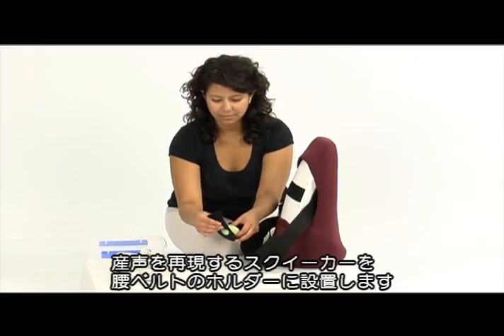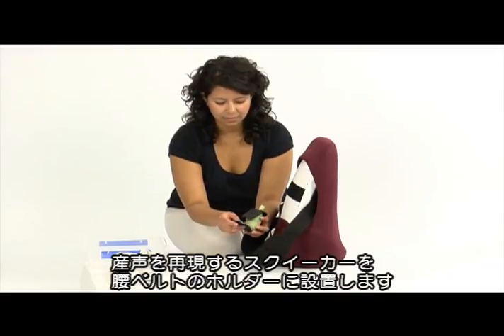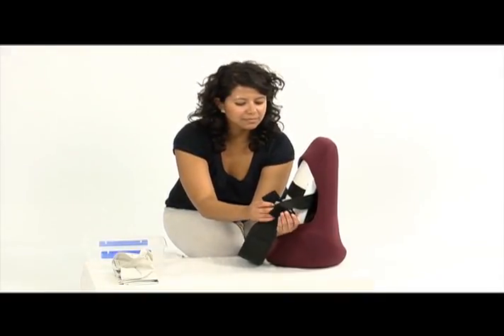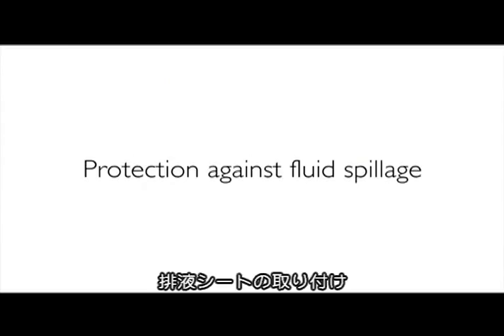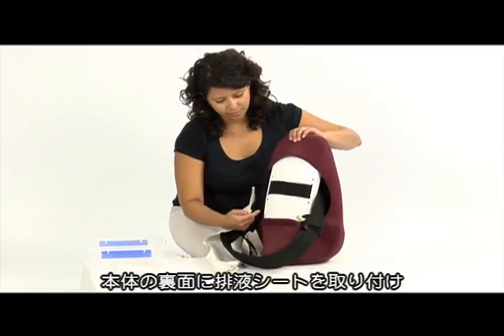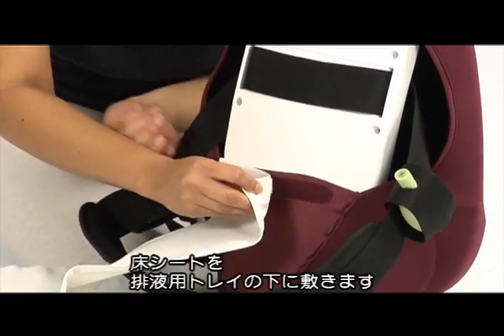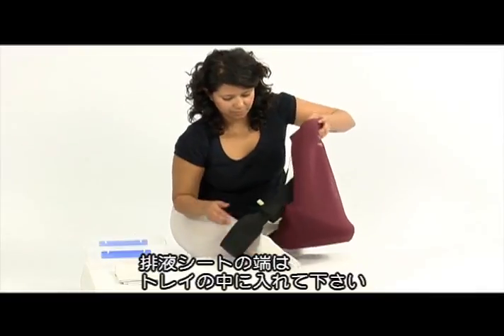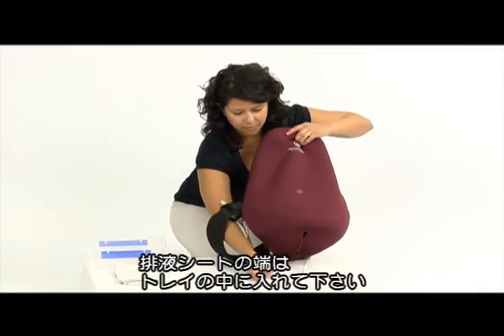Place the green squeaker unit from the Neo Natalie kit into the holder of the Mama Natalie waist belt. To avoid spillage, attach the fluid drain to the back of the skeleton. Place the floor protection under the collection tray. Ensure that the end of the fluid drain is inside the collection tray.